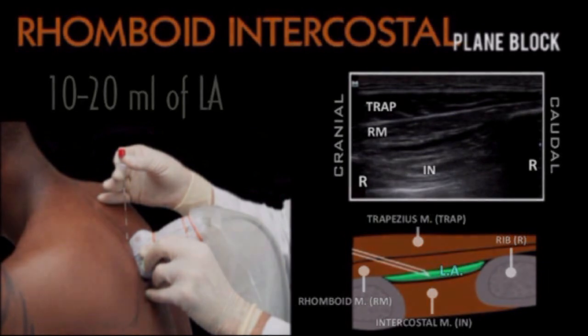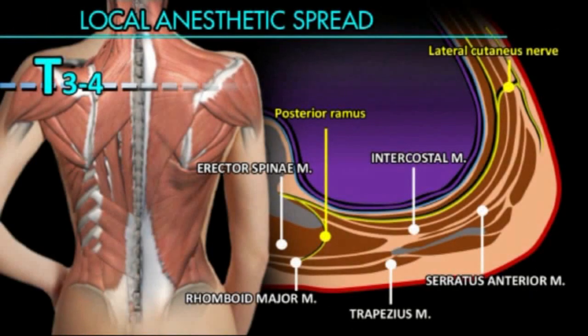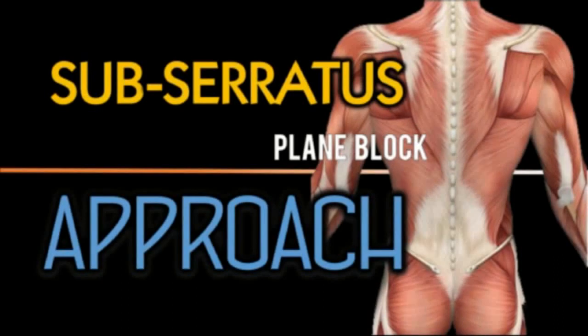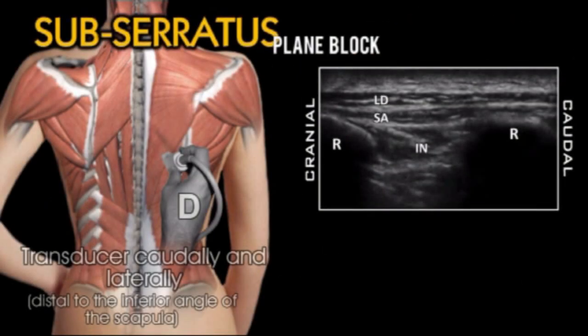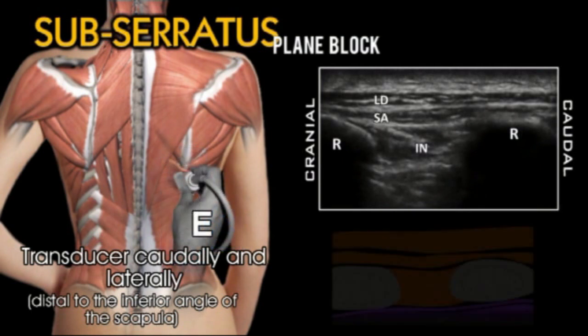The local anesthetic spreads deep to the scapula and serratus anterior muscle, targeting the lateral cutaneous branches, and spreads medially deep to the erector spinae. To identify the sub-serratus plane, move the transducer caudally and laterally, distal to the inferior angle of the scapula.